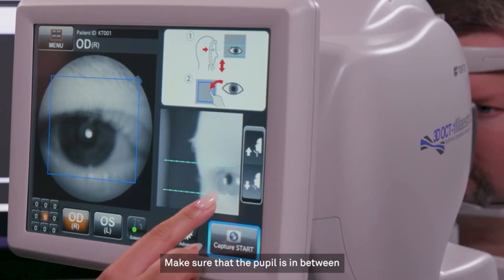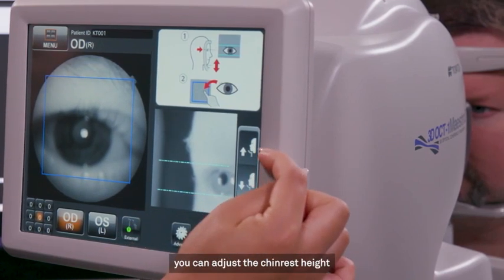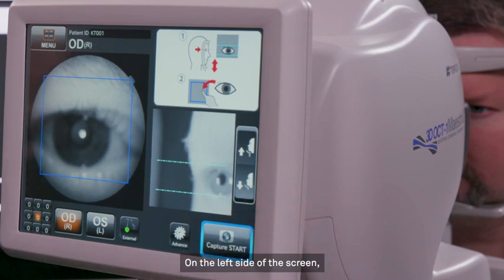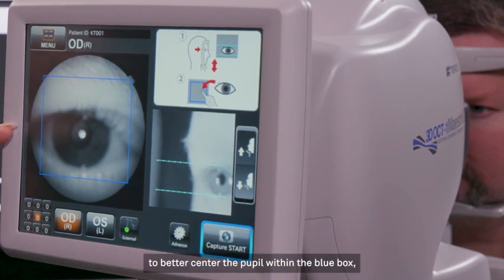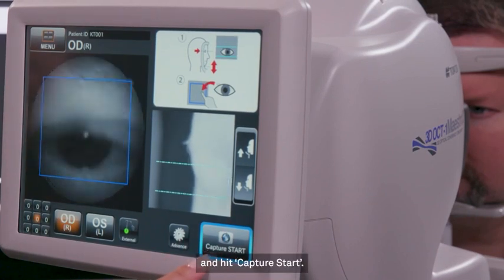Make sure that the pupil is in between the dotted lines. In order to move the pupil position, you can adjust the chin rest height using these up and down arrows. On the left side of the screen, to better center the pupil within the blue box, tap the center of the pupil and hit Capture Start.